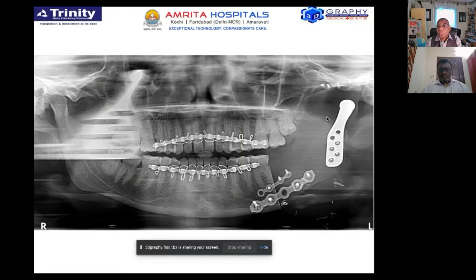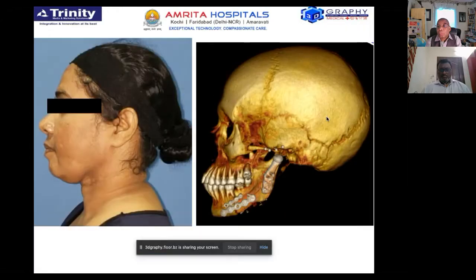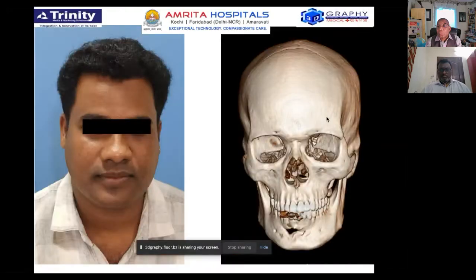To overcome this, we started thinking about custom joints and custom plates. That's when we got in touch with Dr. John Mason, and we discussed the length and breadth of how reconstruction should be done, what problems we have been facing of late, and how we can overcome them.